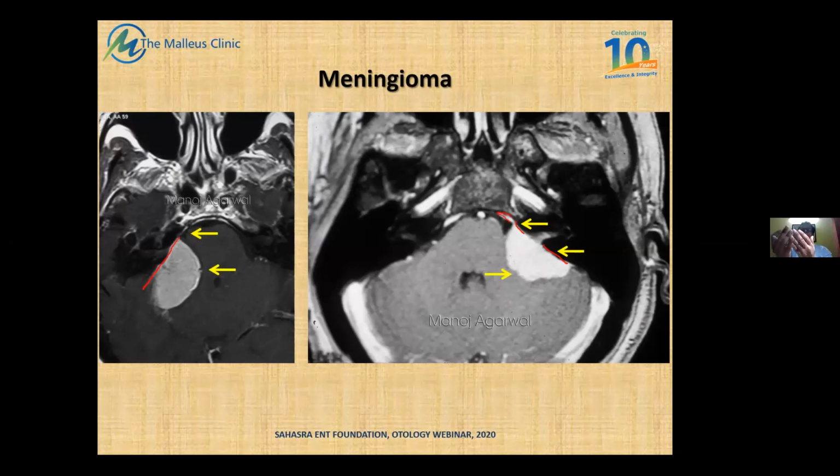Wherever the meningioma ends, there is inflammation of the dura beyond it, both proximal and distal to the meningioma. Because of inflammation or increased vascularity, you would find the dura hyperintense, and this is called the dural tail sign of a meningioma. So a dural tail sign and the flat base of the tumor are more congruent with a meningioma rather than any other tumor.